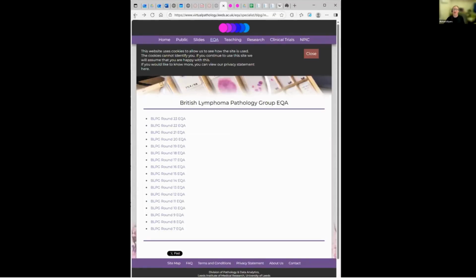so this is the Leeds Virtual Pathology website, which I'm sure many of you are aware of. There's the title at the top there. I'll maybe put that in the chat. It's quite difficult to maneuver on many different screens. But just to get us started, I'll open a chat preview, and then I can manage these things all in one go.